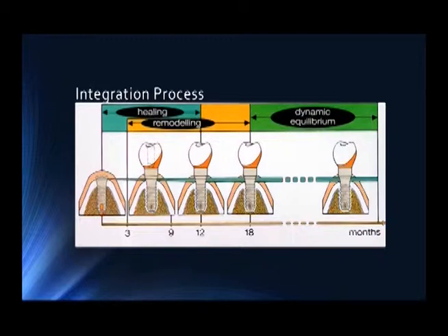And so it becomes more and more steady as the time rolls on, as the months tick by. But it is considered integrated once there is a lack of mobility. So we need to wait that time period, which is going to be different for everyone, like counting days. So they usually group it into terms, and then they're going to perform what they call a torque test, which is when the surgical doctor is going to try and see if it moves.